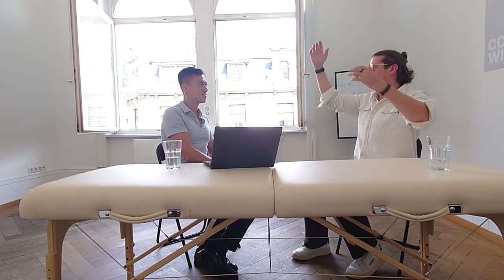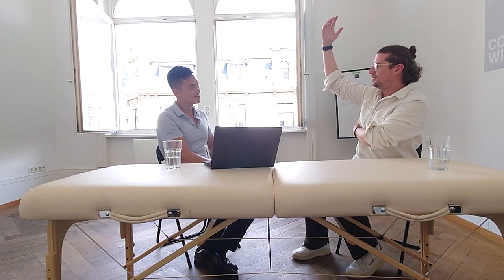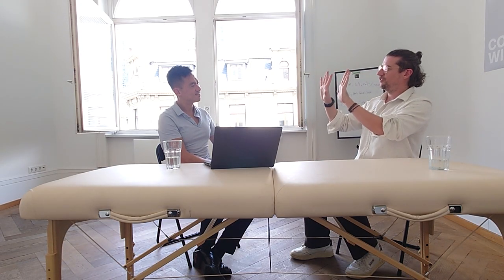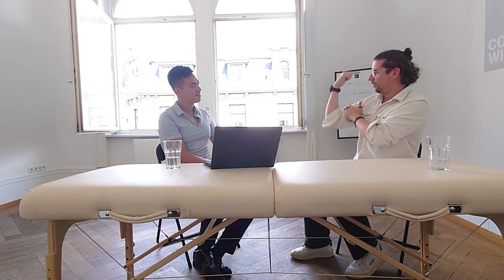So I put the sensor on the lat, and then I put a sensor on the potential compensating muscle. Then you can see, okay, I want to have at least the same activity in the biceps, or in the timing. Because there are muscles we call stabilizers and others are the movers, and the stabilizers always have to be active before the movers. In your pull down, the lower trapezius is a stabilizer for the scapula, and the biceps is a mover.